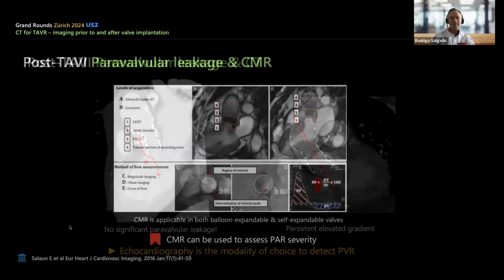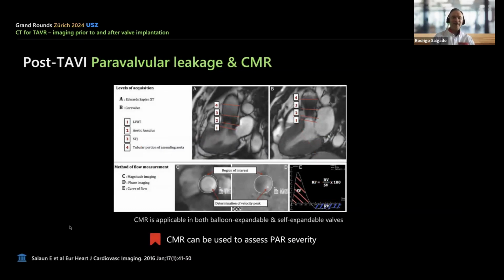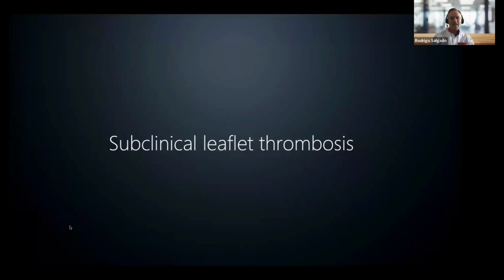Now, can we quantify paravalvular leakage with MR? Yes, we can. This paper from Marseille shows us just that. But I must say, I have never got one single request to do an MR for this indication. Mostly it is solved with ultrasound.